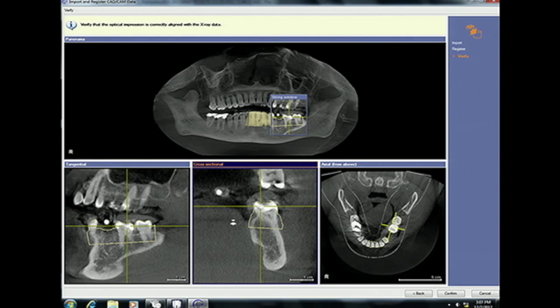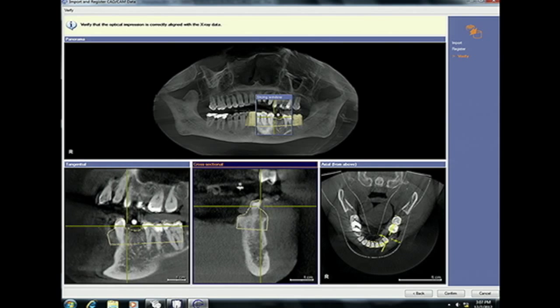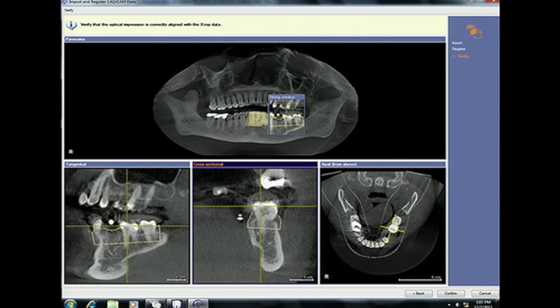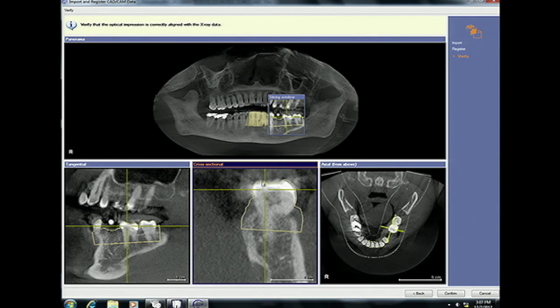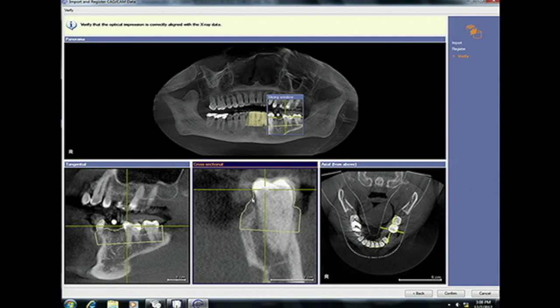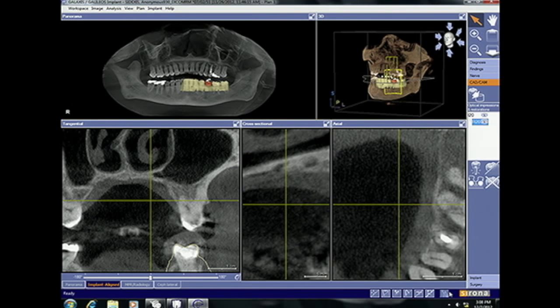You can see that the datasets have matched up very nicely here. One benefit of having both datasets is that radiographic data is missing soft tissue anatomy. The yellow outline of the CAD-CAM file matches nicely with the radiographic data from the Galileos. That yellow line falls off close to the gingival anatomy, and this is critical data for anterior zone implant planning — it allows us to understand the thickness and biotype of the tissue. So it allows us to truly assess patients from all standpoints: the tooth itself, the topography of the gingival architecture, and the radiographic data provided by cone beam.